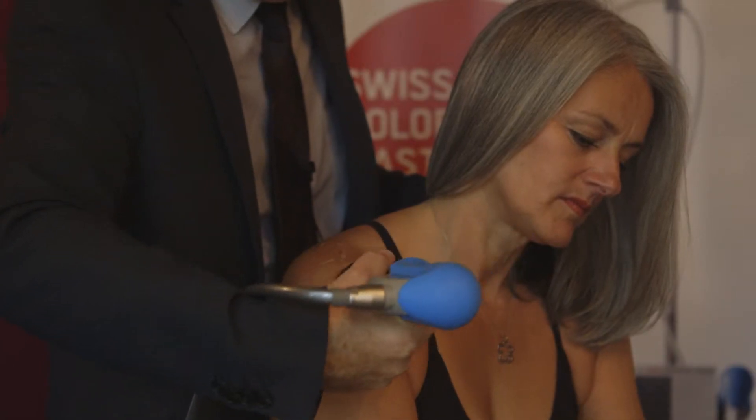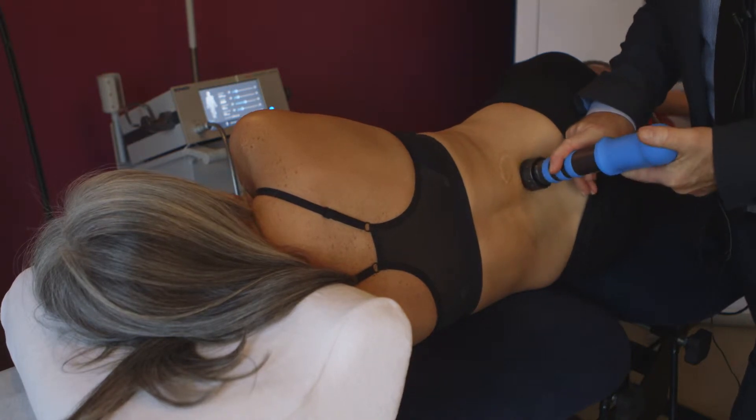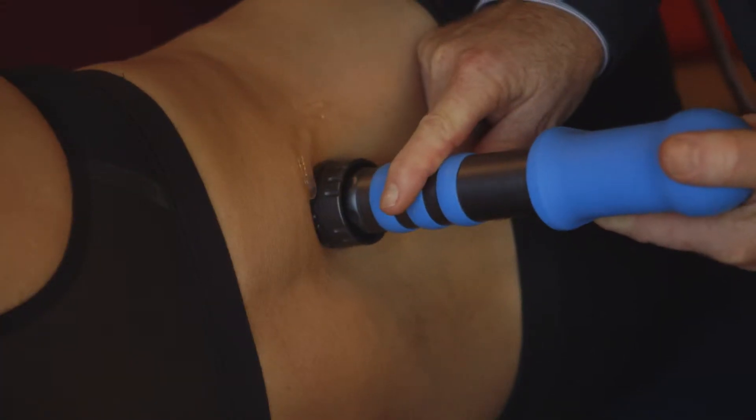Treatment protocols. This has been helped enormously by the EMS app. For example, calcific supraspinatus. In this we discuss air pressure, we discuss number of shots, we discuss frequencies, we discuss the appropriate literature and indeed contraindications. Also, later I will be discussing my own way of delivering the shockwaves for this appropriate treatment.